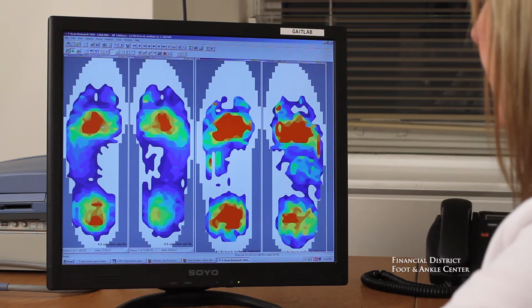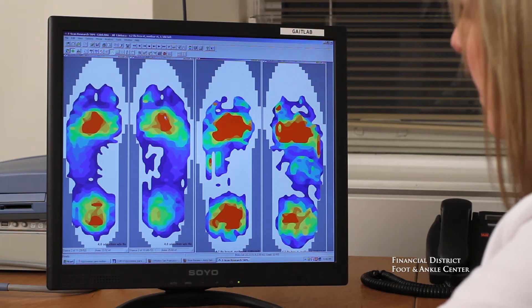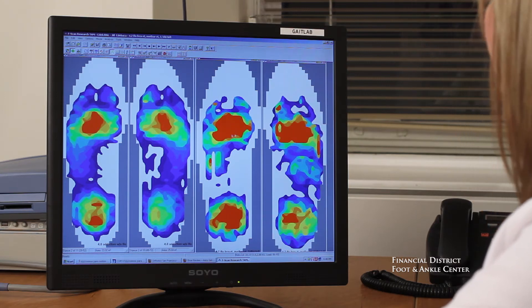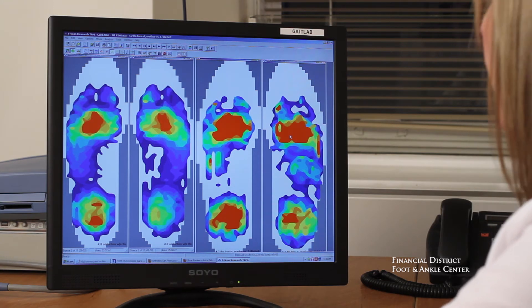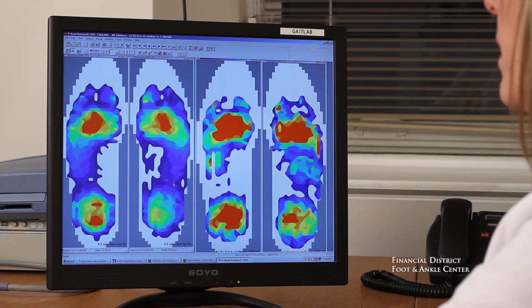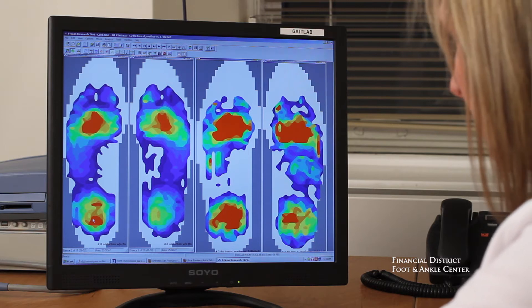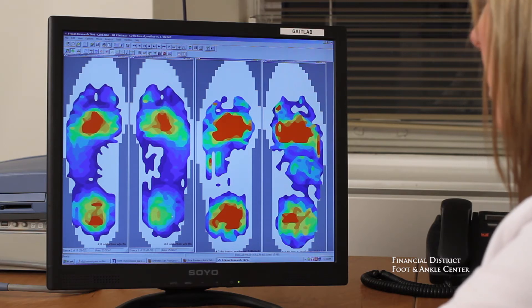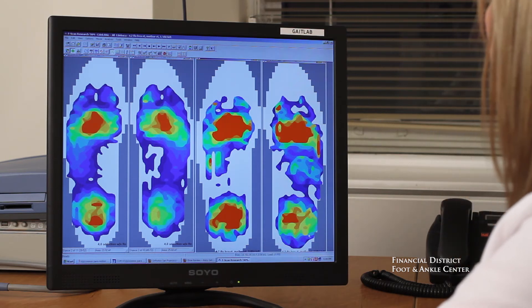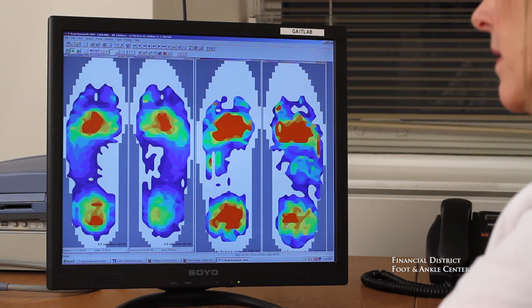Normal pressure should be evenly dispersed across the forefoot. In the before, the pressure is primarily dispersed under the second toe, and in the after, you can see a much better pressure distribution across the entire forefoot. There's also pressure under the left heel in the before, not so much after. In the after study, we can see much better symmetry between the right and the left.